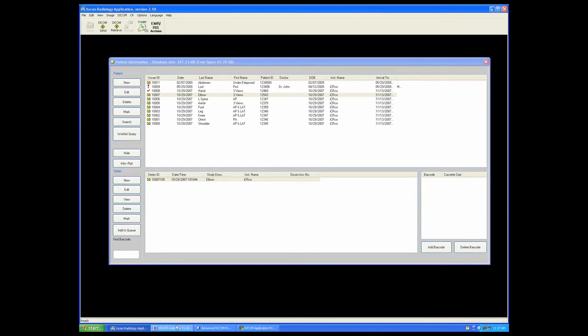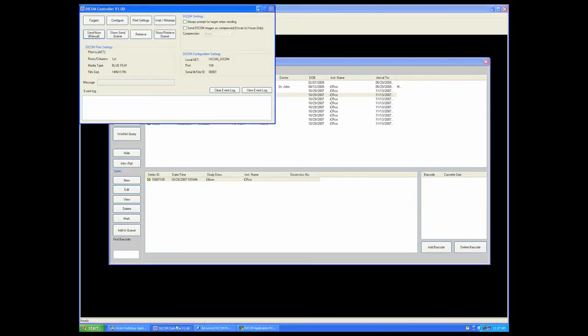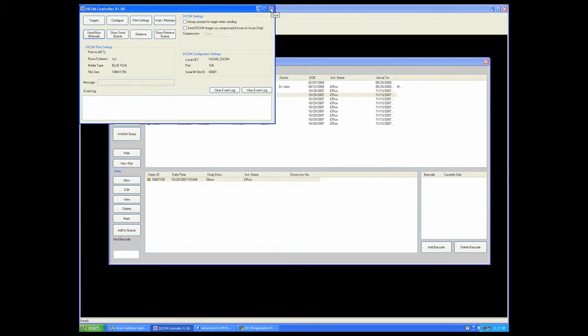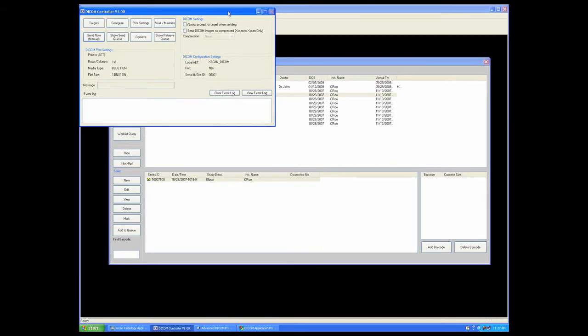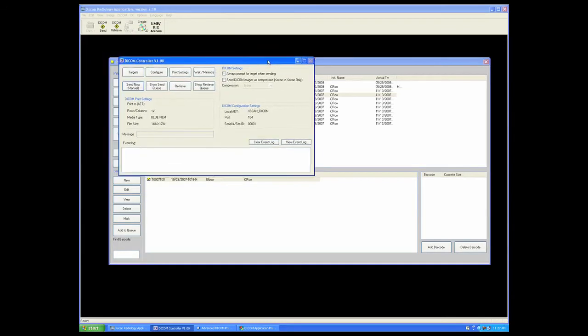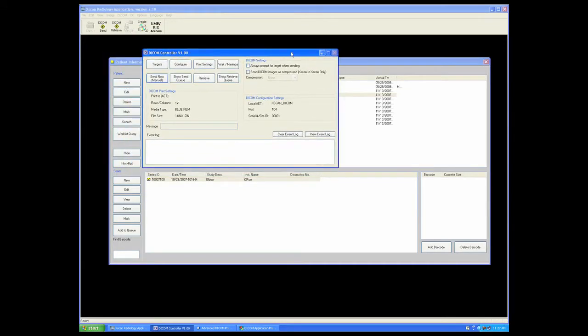Your DICOM controller will always be running when your software is running once it is enabled. Please note that the X is grayed out here, preventing us from closing the DICOM controller because this is a very important tool.